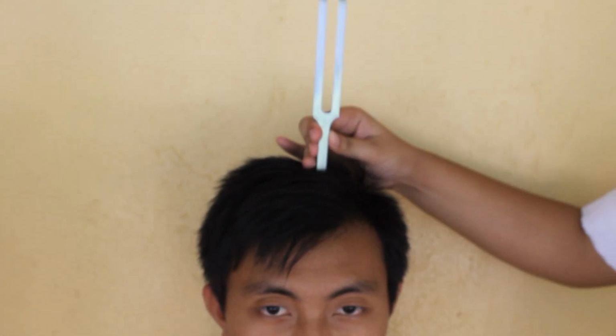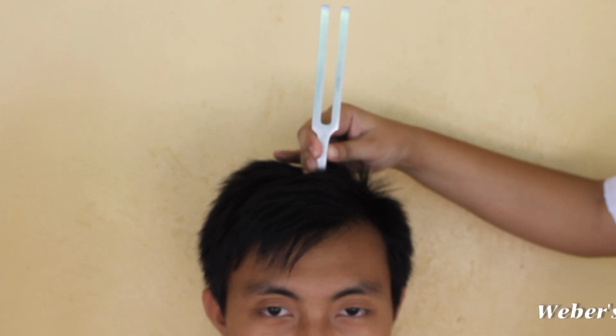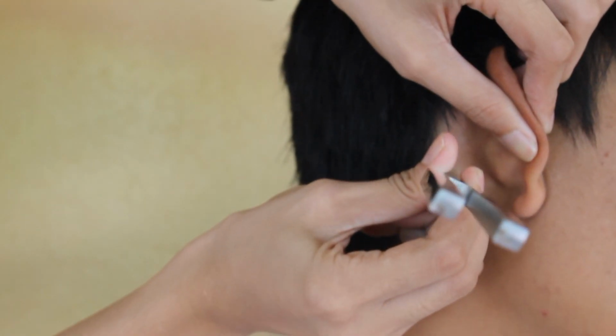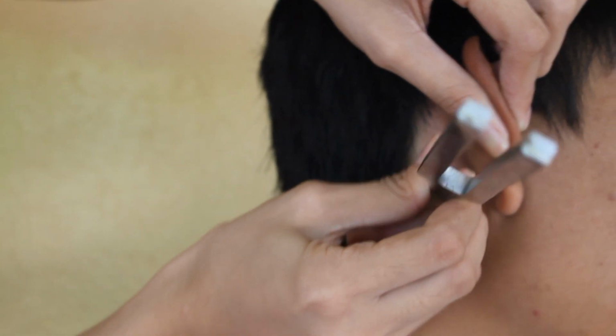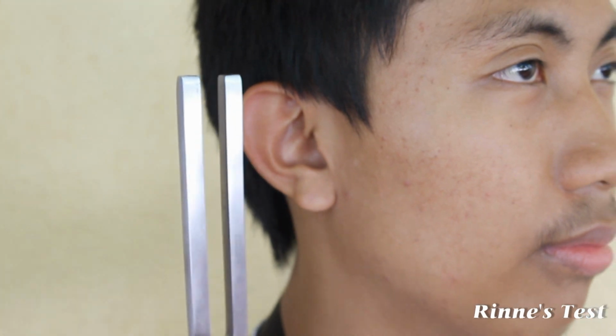For the Weber's test, strike the tuning fork lightly against your hand or on any hard surface. Then place the vibrating fork on the patient's forehead at the midline or on the top of his head. Then for the Rinne test, place the vibrating fork over the patient's mastoid process and ask the patient to tell you when the tone stops.